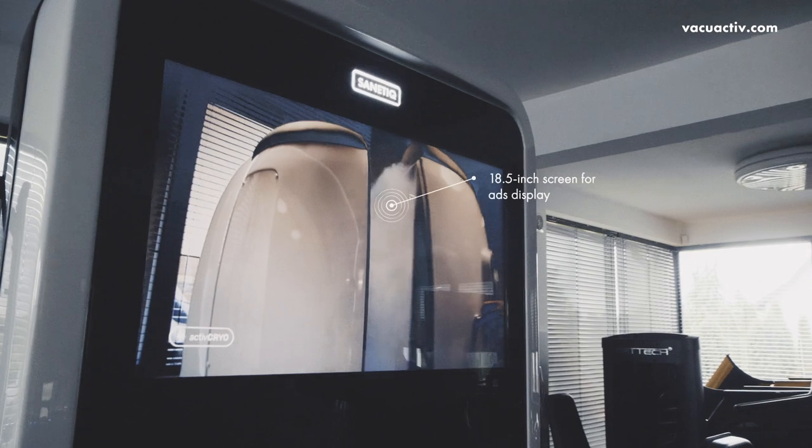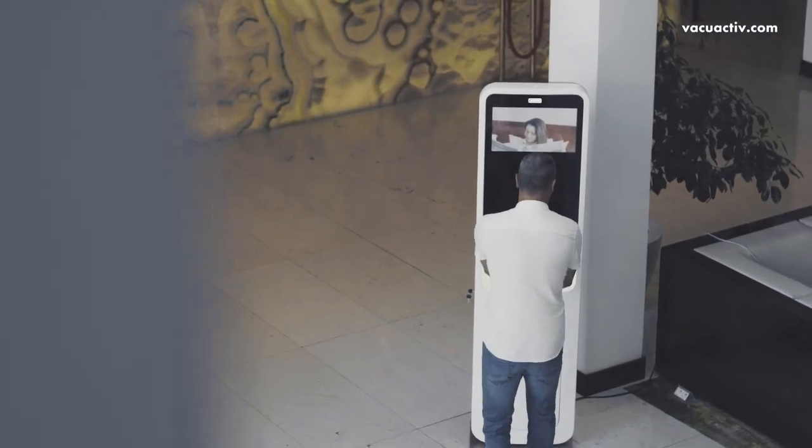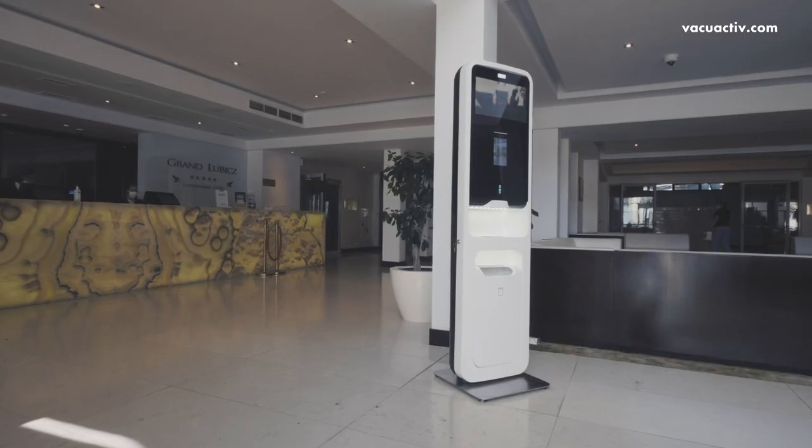But that's not all. Sanitique is equipped with a large 18.5-inch screen for displaying ads or messages in a loop for your customers or employees.